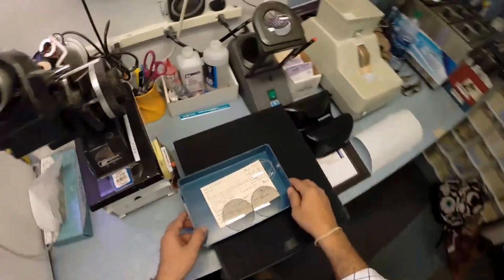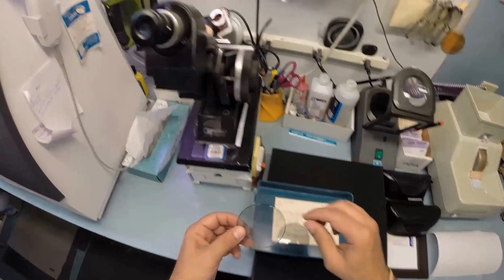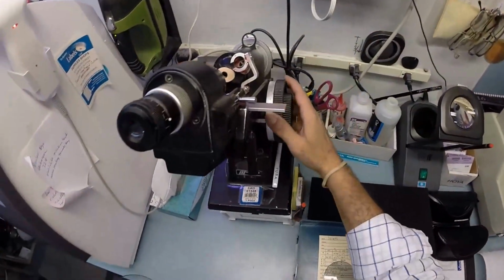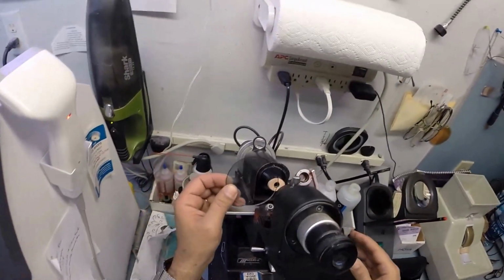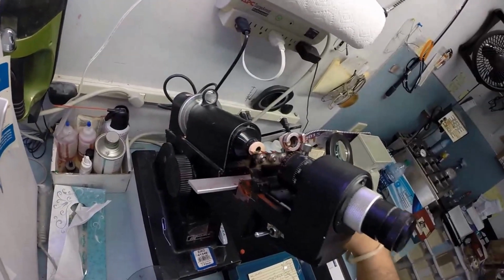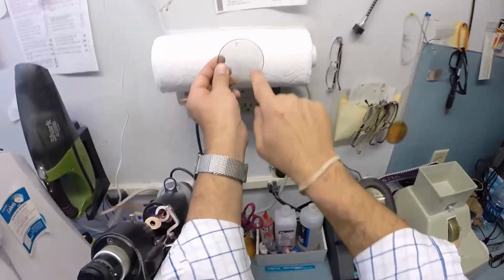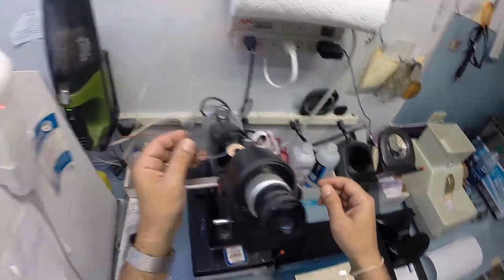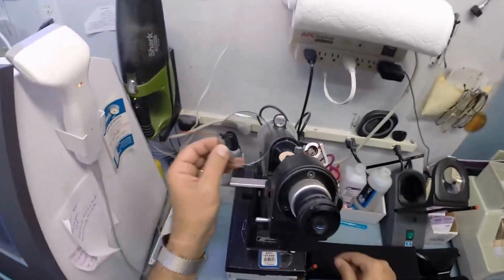Because there's so much to do tonight, I went ahead and put the dots on the lenses that I would normally do. I'd put the lens in. And this is a Marco 101 lensometer. This lets me read the power of the lenses. I would put it in, set the axis wheel, put the power drum on there, put 3 dots on your lenses. It tells me where it's oriented. Hopefully you can see that. That's the right lens. We would do the same thing on this lens, put the power drum in there, and I'll do it at the very end.